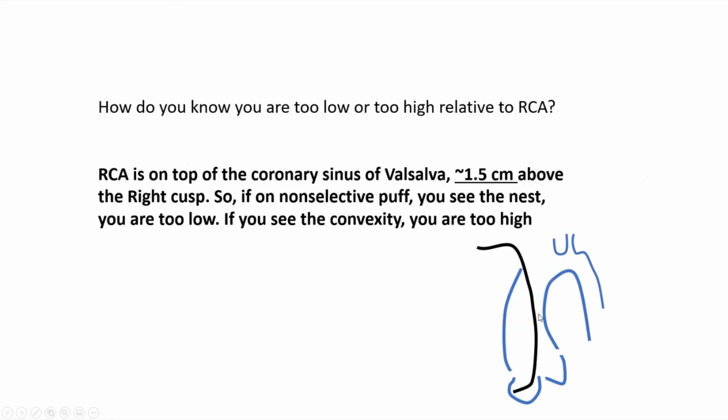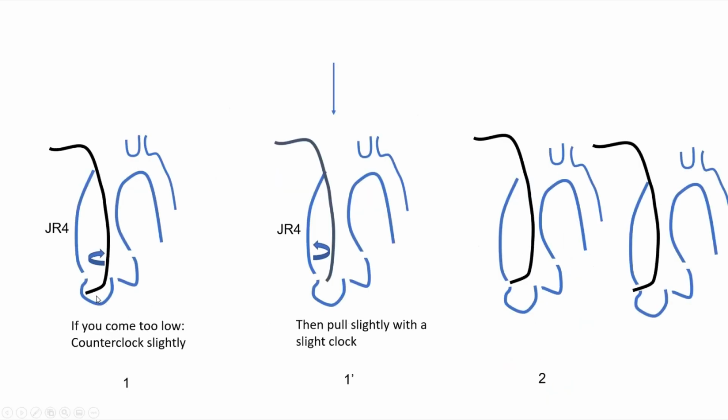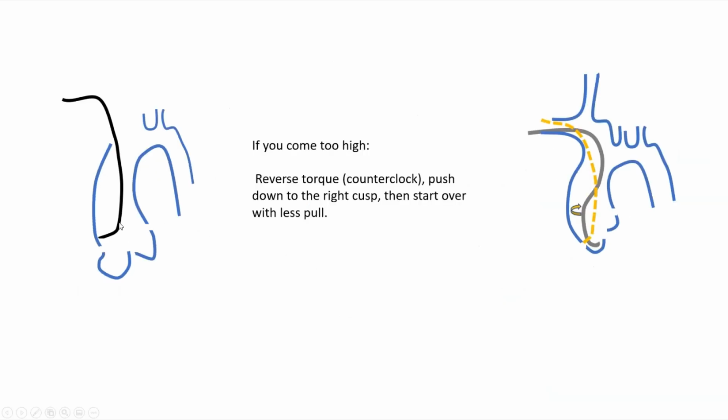This is the case where the catheter comes too low in comparison to the coronary ostium. Keep in mind the RCA is on top of the coronary sinus of Valsalva, about 1.5 centimeters above the right cusp. So if on non-selective puff you see the nest, you are too low. If you see the convexity of the tubular aorta, you are too high. And here you are too low, you counterclock slightly, you pull, then you slightly clock to engage, then you push it in. Here you're too high, you counterclock, you push it back down, then you clock and pull to engage. And you pull a little less than you did the first time.